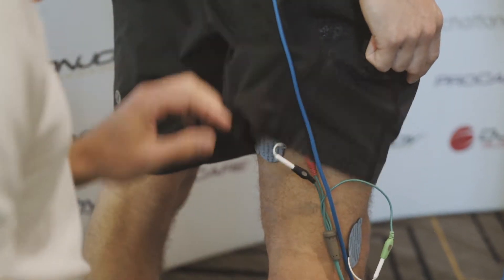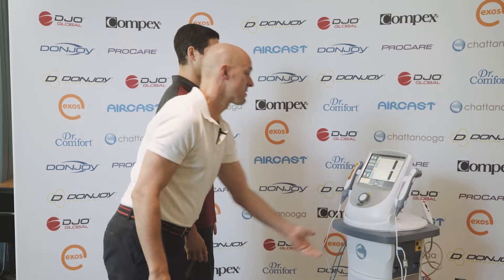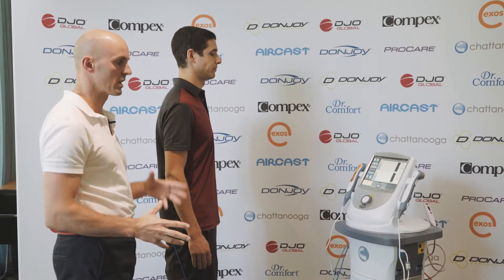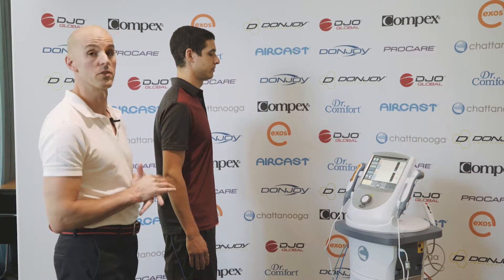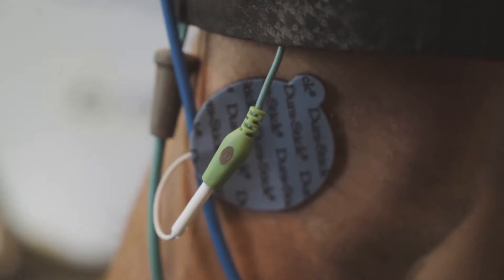Now we've got channel one going to his glute and channel two going to his hamstring. So now we're going to get Ryan to do another squat, tracking the activity in his glute and his hamstring — looking at what those muscles are doing and when they're doing it. Ryan, hands out for us again, just let that cycle through for a sec.